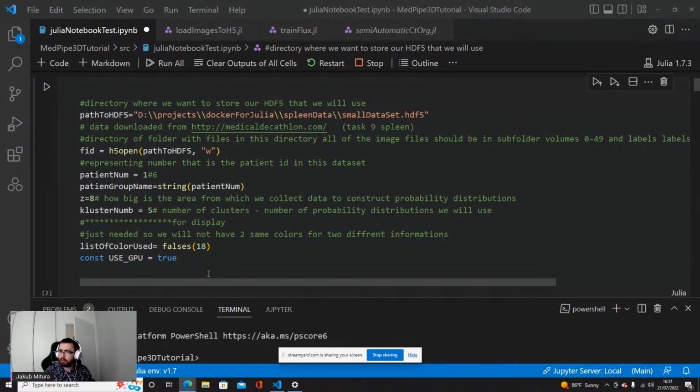Okay, so I'll give you 2 minutes for loading the libraries. Okay, some new question. Have you also considered to calculate exposure time for cancer treatment with your program? Is it possible?